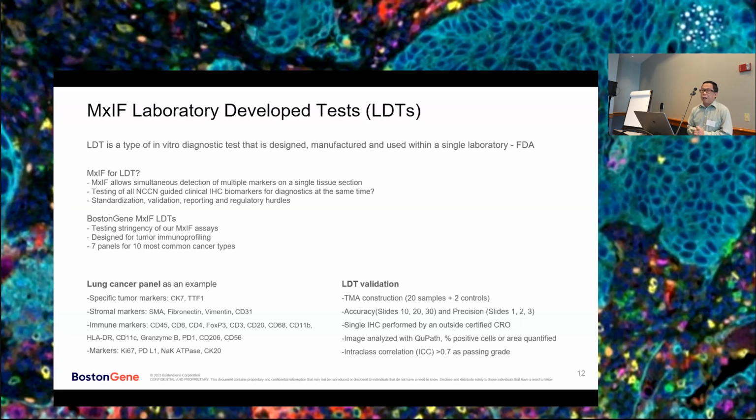So MxiF for LDT. We know the value of MxiF LDT because right now, for diagnostic and treatment purposes, a lot of single IHC has been employed in clinics. So if MxiF can stain multiple markers on one slice, why not? The value is not questioned. There are different issues involved.